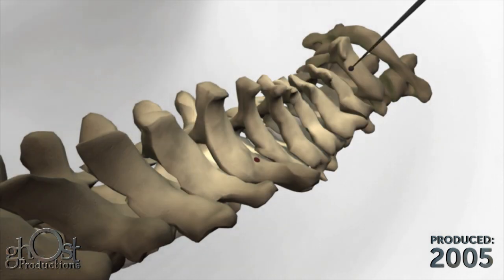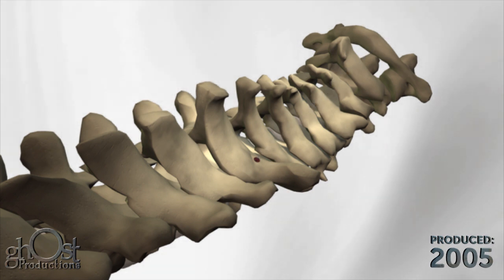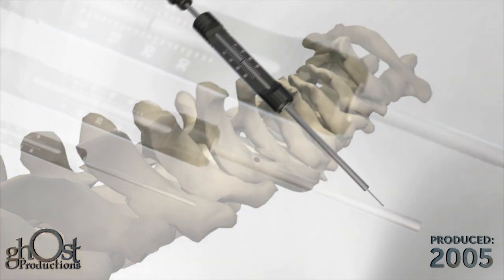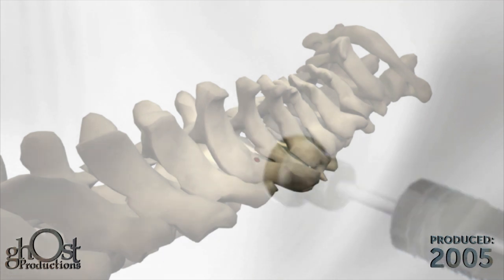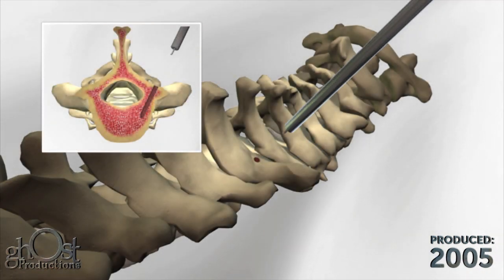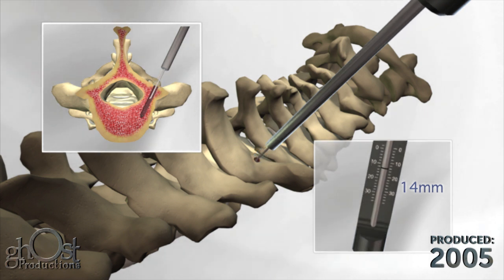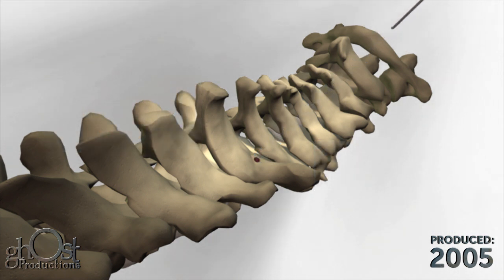Insert the sounder into the pedicle to verify the integrity of the pedicle wall. The depth of the drill hole can be confirmed using the depth gauge. Insert the tip of the depth gauge into the drill hole until the tip contacts the bottom of the hole. The depth can be measured by reading the scale located on the shaft of the depth gauge.